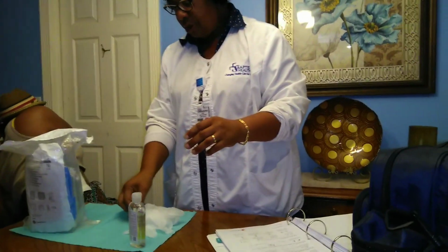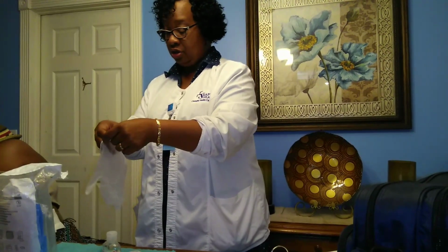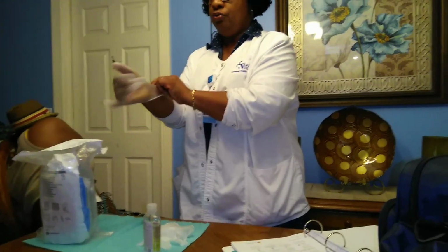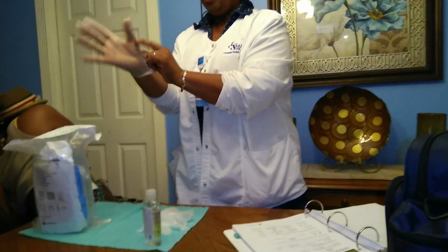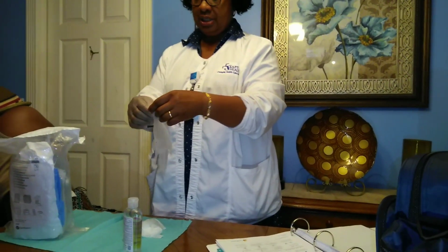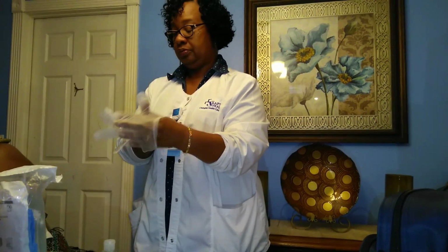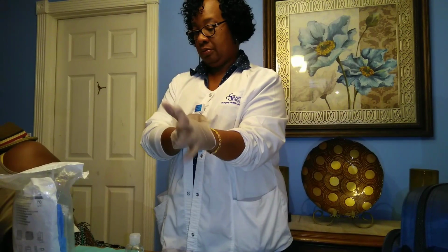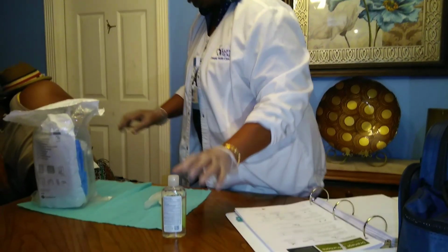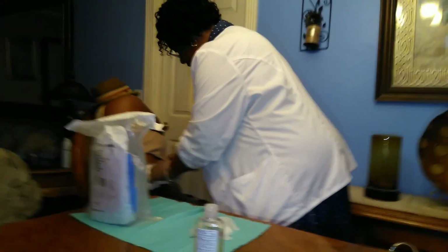So I'm going to put on a pair of clean gloves. You've got to make sure your hands are completely dry to put on your gloves, because I'm going to remove the old dressing. I'm going to also make sure that I have a trash bag available to put the old dressings in. Okay. So I put on my gloves. The patient has a dressing intact. I take the old dressing off.